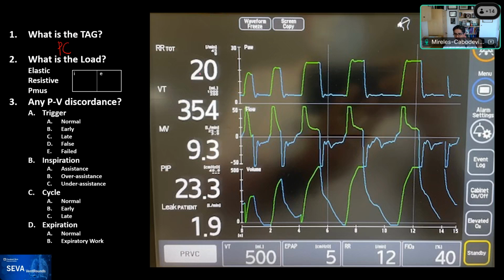And so let's just talk a little bit about that. And we know that what is controlled is pressure. And it's pressure because, first of all, if you look at the flow, every single one of the flow waveforms is different. And you can see actually the pressure has a square waveform throughout, and the volume has varied throughout. So we're definitely not controlling flow during the breath. So we're controlling pressure. You can see that. So, Rob, any comment about pressure? Not about pressure, no.